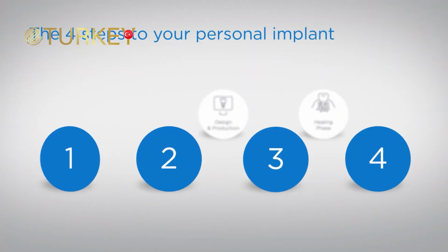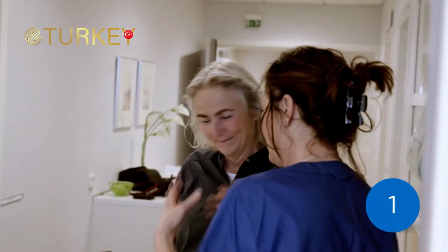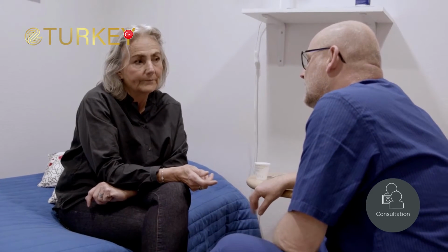To replace a tooth with your personal implant solution, 4 steps with your dentist are required. The first is a consultation and information step. This film supports a dentist explaining the treatment options for your individual situation.